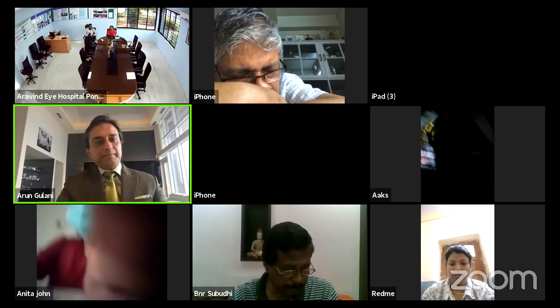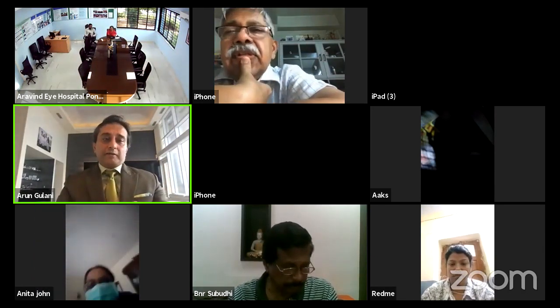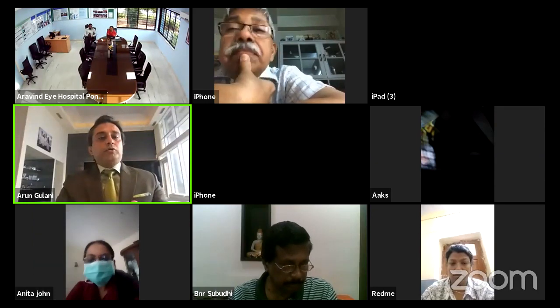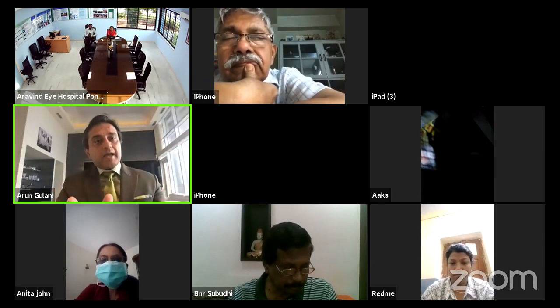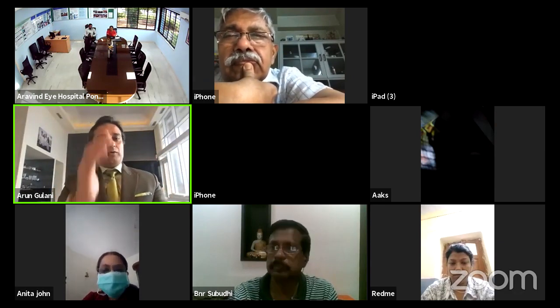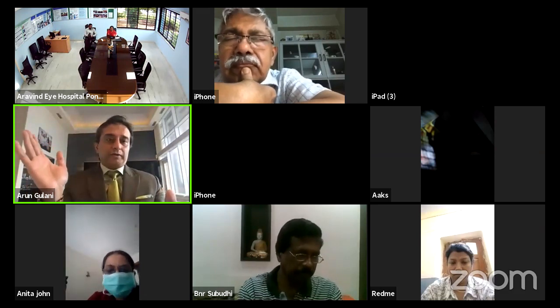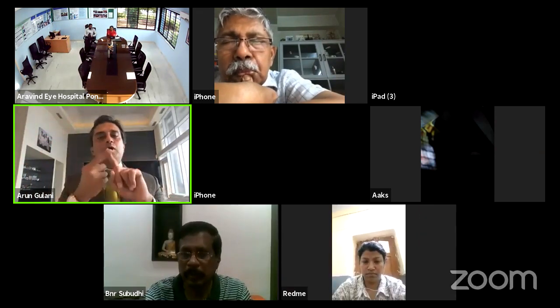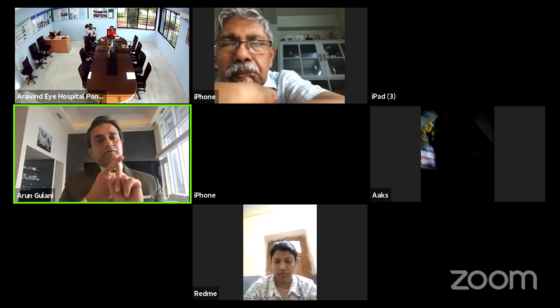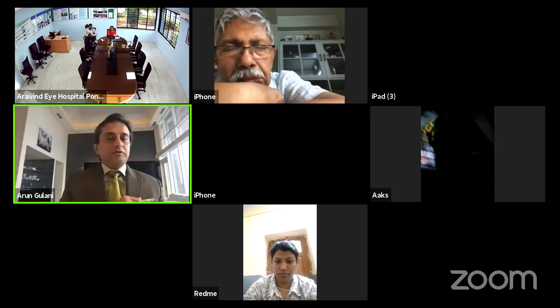Absolutely. Yeah. Now, one thing, sorry, let me interrupt. When you say combine, I get this question a lot too. Would you do that with cataract surgery? Would you do pterygium? The answer is never. Again, accuracy is your goal. When you're doing cataract and LASIK or whatever, among 28 different refractive surgeries, you want perfection. You cannot have perfection if you're doing two variable surgeries. So wait, perform.